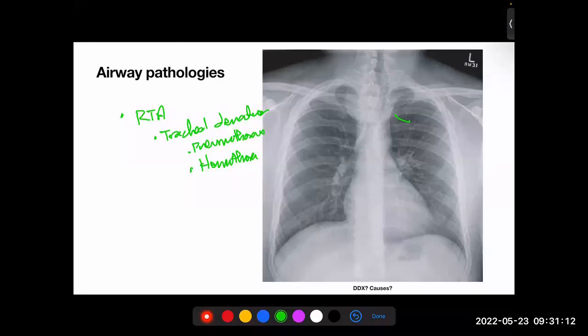I don't agree with you. It's close to consolidation, but it's not quite the word I'm looking for. There is something called rib crowding, crowding of the ribs. The ribs are too close to each other. The spaces between the ribs become smaller, so you cannot percuss.